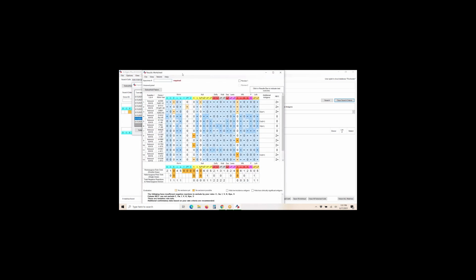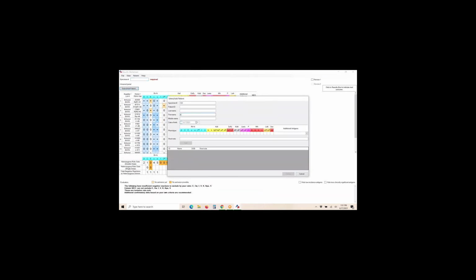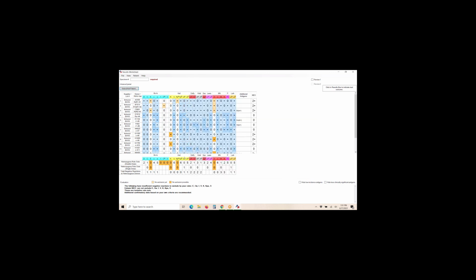And we're going to bring in our panel. So of course you get a positive screen. You probably already threw the panel on already. And your panel is going to show up. So you do the exact same thing again. There's your patient requiring your sample.